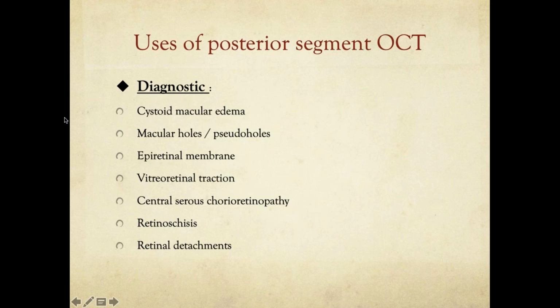So in these patients, just looking at the central macular thickness just before the surgery is not good practice.